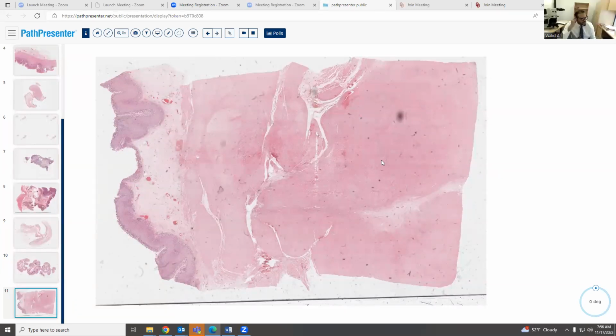Yeah, that's a good question. As I said, tangential cutting can make you think the collagen below the epithelium looks like collagenous colitis. However, you're going to see some destruction. Usually in collagenous colitis, the collagen goes down, not just under the epithelium, and can destroy the crypts. You can also see some inflammatory cells intraepithelially.